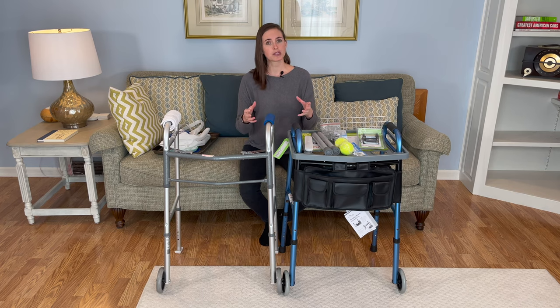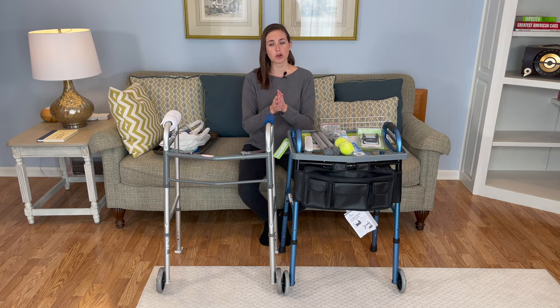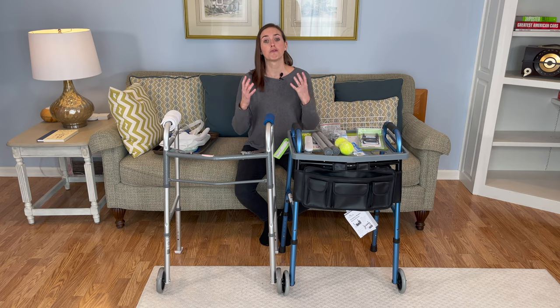As we always say in the rehab world, the best walker is a used walker. So if you're going to be using a walker, you want it to be functional so that you can use it in all aspects of your life to maximize its safety benefits and prevent falls.